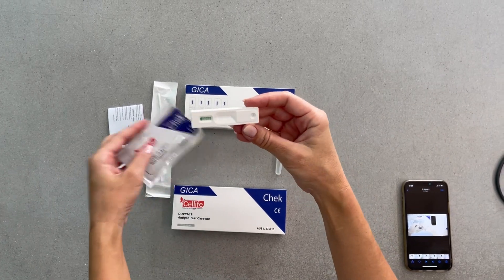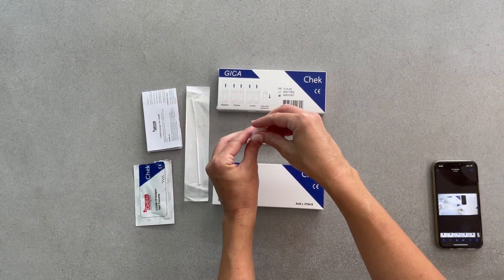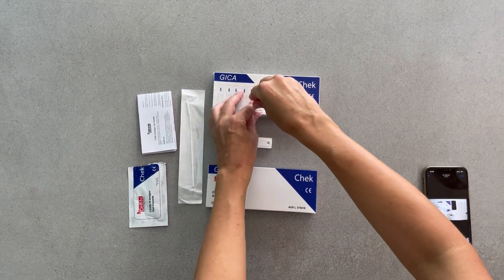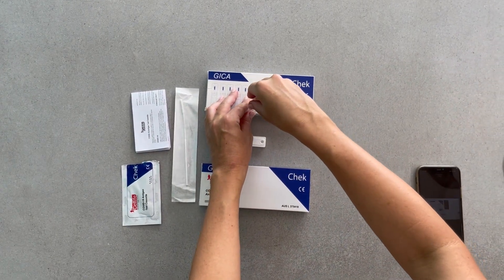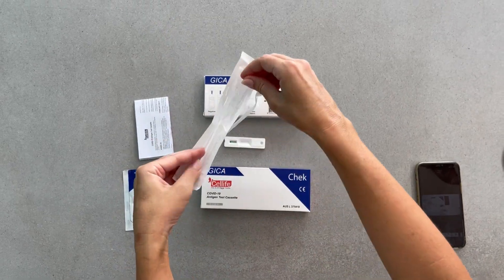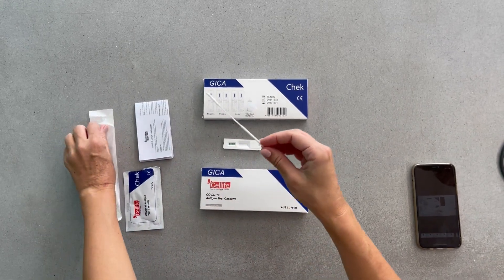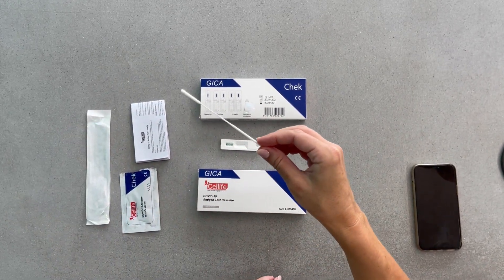After preparing the test cassette, place the extraction tube containing the buffer solution in the well provided on the CellLife box. Using the sterilised swab provided, take a sample for 15 seconds.